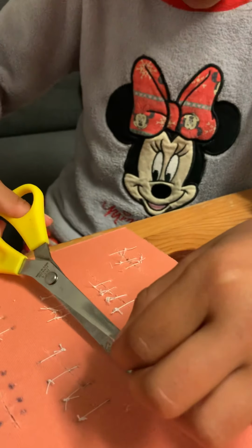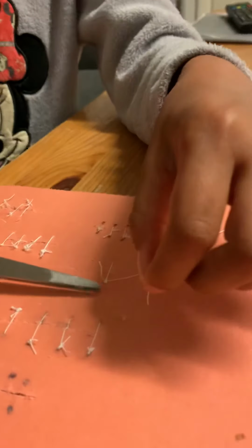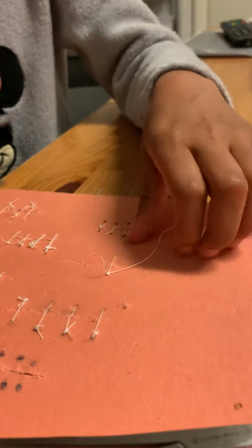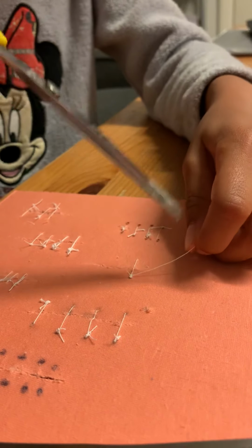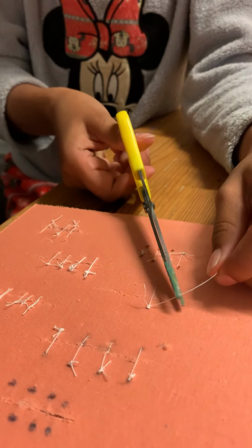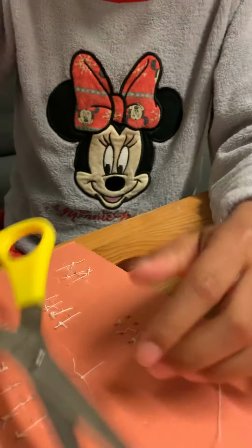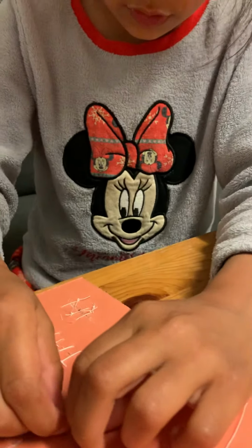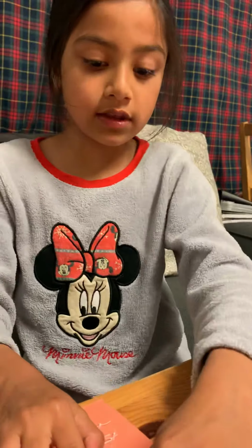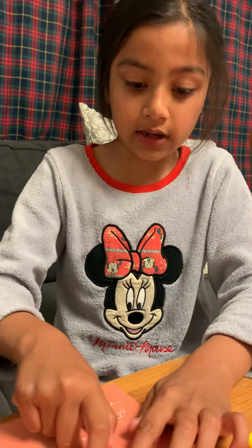And snip it, I would say about that much. Not too short like that, and not too long like that. I think this much is about enough, and then you can do the same to the other one. But the other one has to be a bit longer. I think that's better, so it can be more secure. And just to make sure, you can pull this a bit, and pull this a bit. And now the stitch is fully ready.